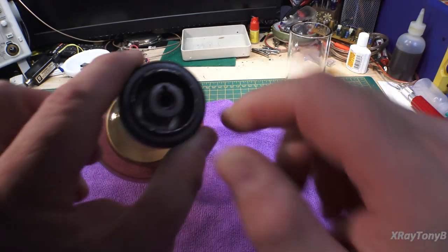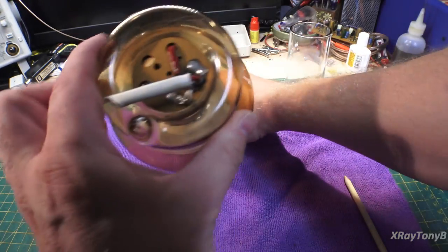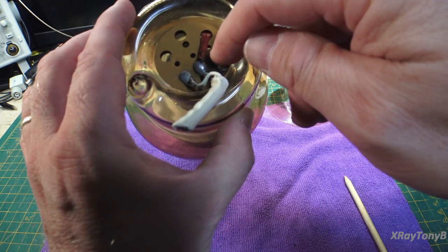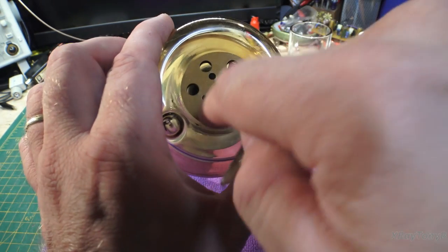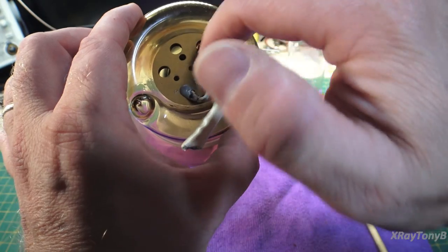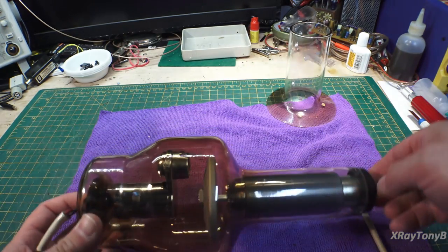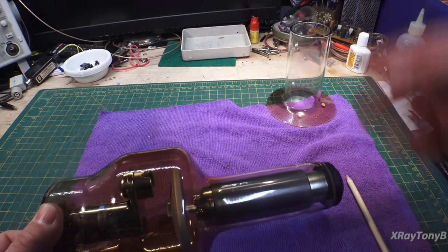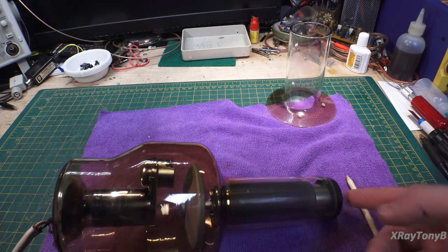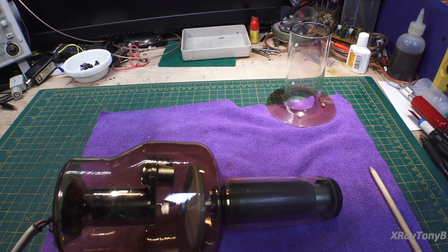And the anode connection is right here. There's a screw terminal where you would connect one side of the high voltage, and then the other end of the high voltage would connect on here, which if you look, you have your three filament windings. There's a common one where the two filaments are tied together on one end, and then there's the small filament and the large filament. Not only do you have a current loop from common to the filament, but you also have, connected to the common, your negative high voltage. So it's a differential power supply. You have a negative high voltage going in here with reference to ground, and a positive high voltage with reference to ground, I'm sorry. And the differential between that negative and positive high voltage is the actual voltage being applied between anode and cathode. So that's how it works. But anyhow, just a quick overview of an X-ray tube.